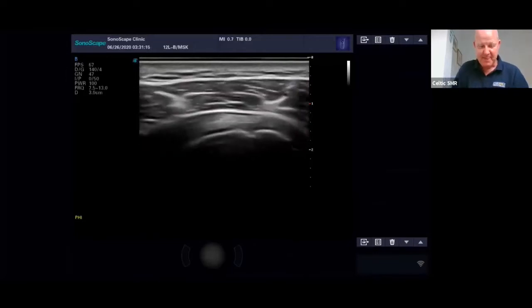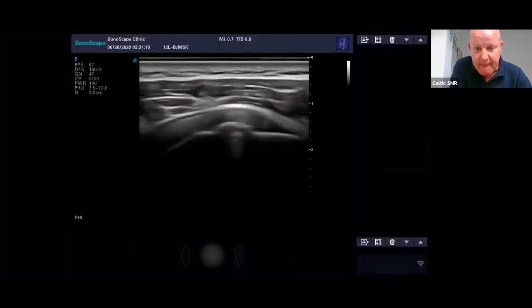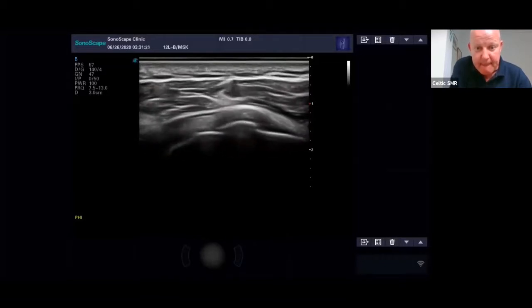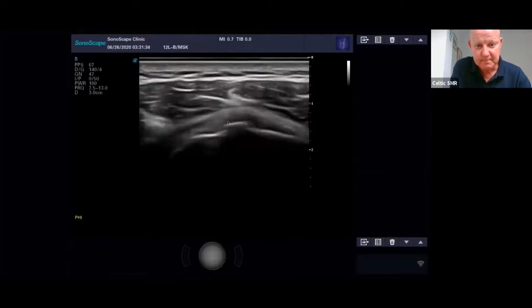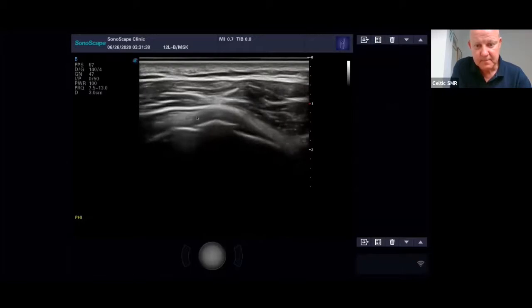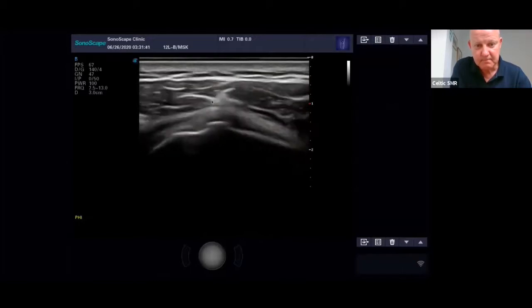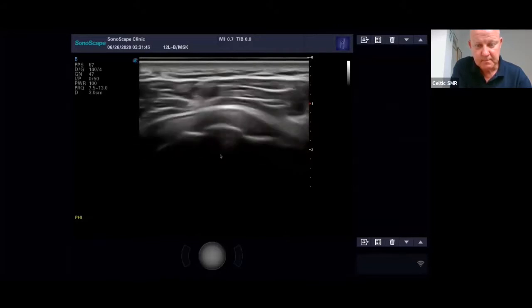Another thing to be wary of is the deltoid muscle, because I don't know whether you can see here, when you get a composite of the fascial planes of the deltoid muscle, it can cast a shadow down and through. So just bear in mind that that's not tendinopathy of your tendon. It's the fact that this is coming through and casting a shadow through that.